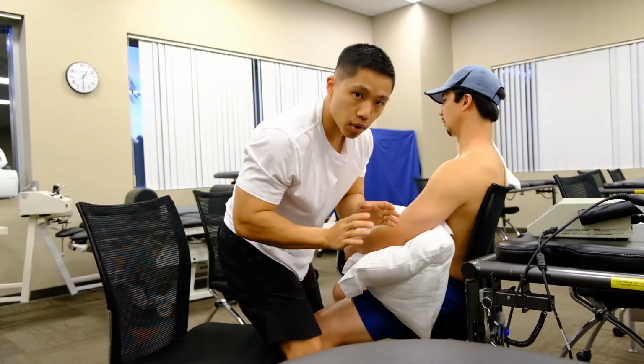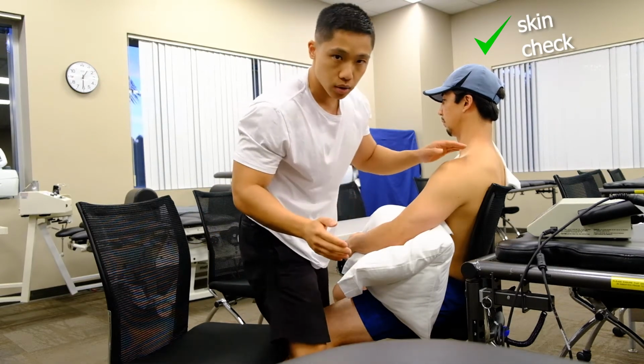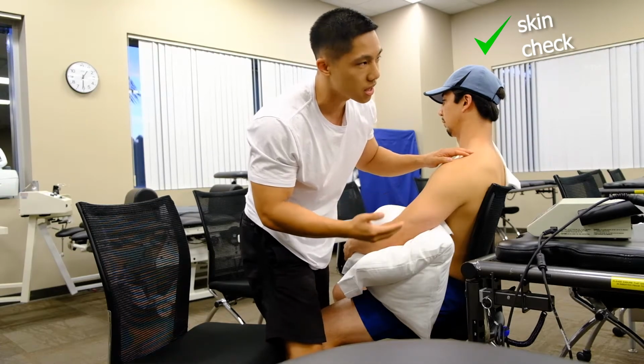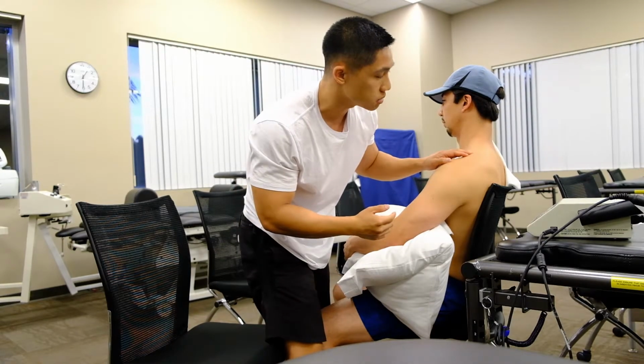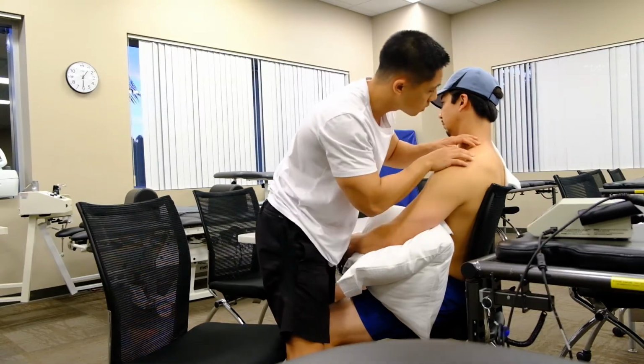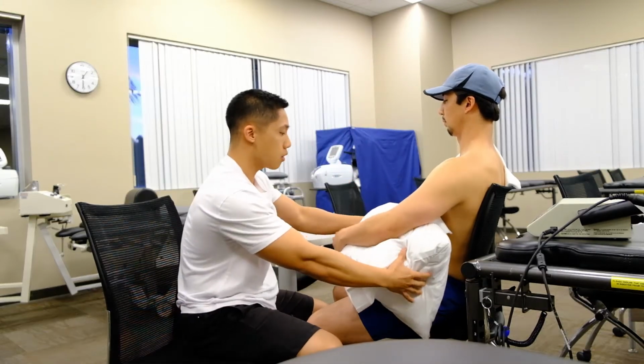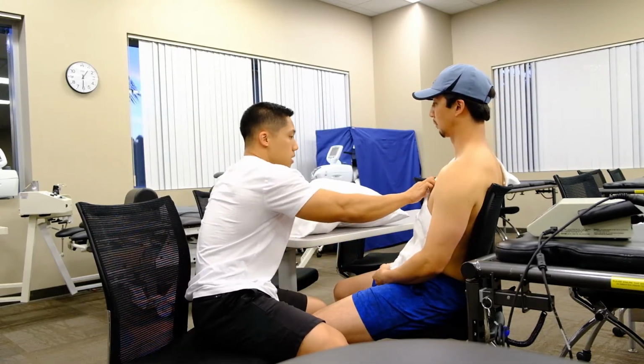And then at this point, I'm going to go ahead and do another skin inspection just to make sure that there were no burns or any sort of wounds attained during this modality treatment. And everything seems to be in order. So finally, I'm going to go ahead and remove this and this.